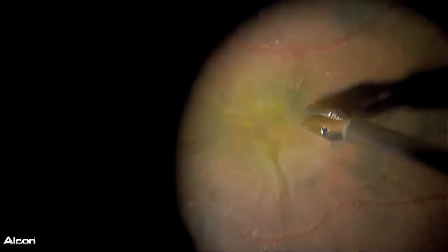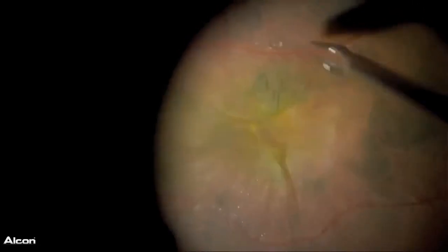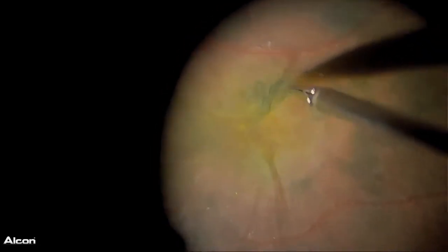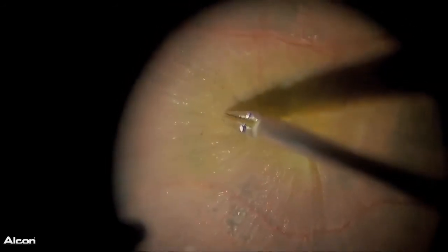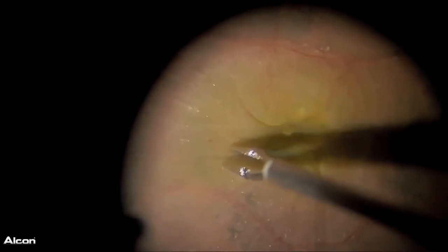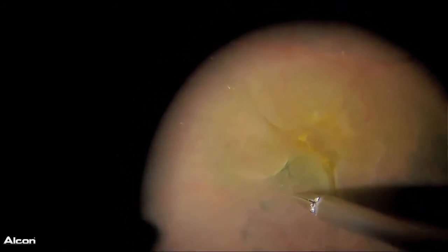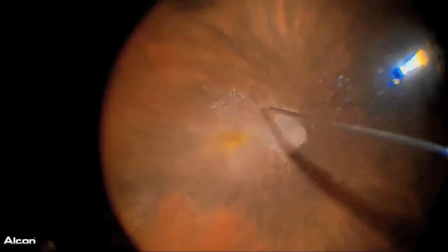After complete removal of the epiretinal membrane, I routinely remove the internal limiting membrane stained with ICG with 25 gauge vitreous forceps. The contact lens gives us a higher magnification, as the video shows, and we have better and higher resolution with the Ingenuity system with the contact lens system.